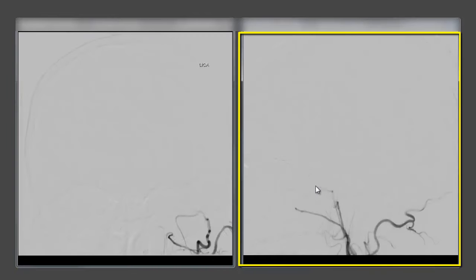Here we see the patient's catheter angiogram performed for endovascular stroke treatment and this will illustrate that in fact this is a carotid terminus occlusion not an occlusion in the neck. Here we have the intracranial views of the common carotid injection so catheter in the common carotid artery in the neck. We're taking an x-ray movie here of the patient's skull. You can see the subtracted skull here, the orbits, the top of the head in the AP or forward view straight ahead and then the lateral or side view here. Here's the skull base of the patient and the orbit here.